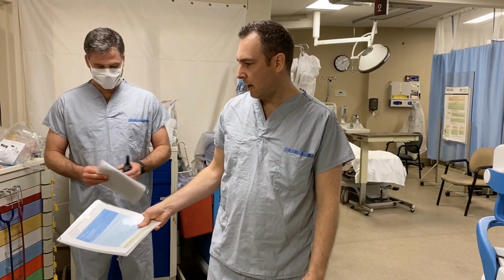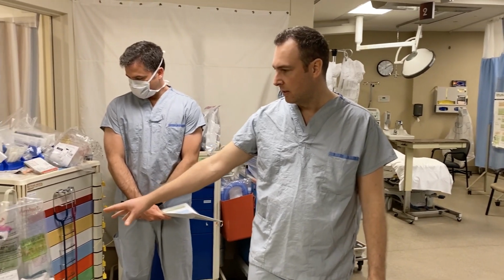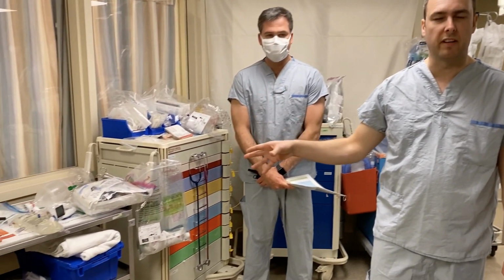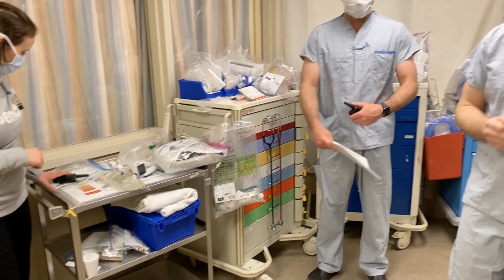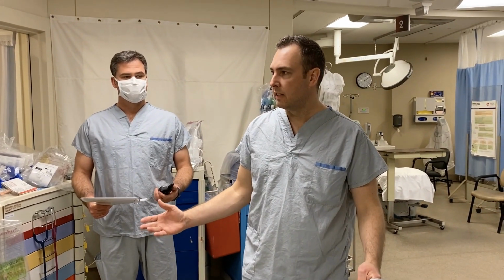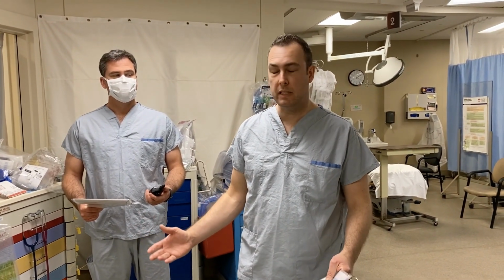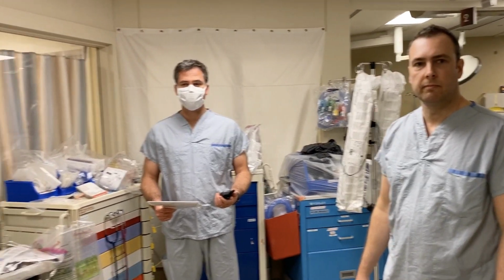We're going to get our cart. We're going to drop off our blue anteroom box and our clean blanket for later on after we intubate the patient. The rest we're going to bring in the room with us. We've got a walkie-talkie for the inside team, a walkie-talkie in the anteroom, and a walkie-talkie for the outside team. Is everybody ready? We're happy with our PPE. Is there any questions from the team? Nothing for me. No questions. Everything's all right. Good.